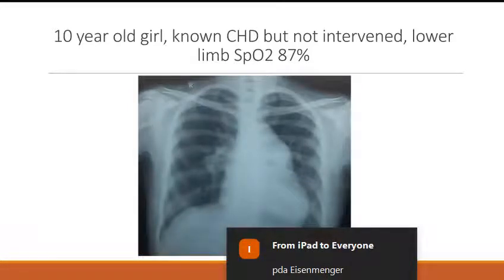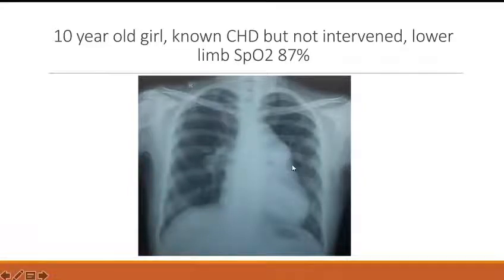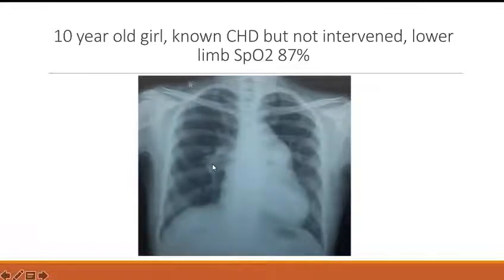Vascularity — RPA — is it not dilated? Yes, RPA dilated. The proximal PAs are dilated. The LPA is overlapped by the MPA so you are not able to see. You are able to see a shadow behind it, but it's okay if you don't comment on that. RPA is significantly dilated.